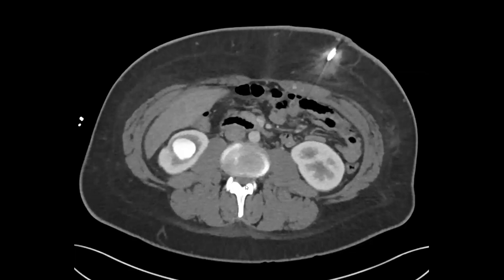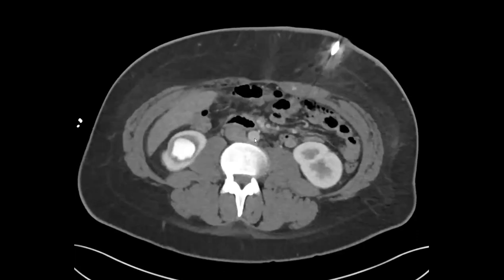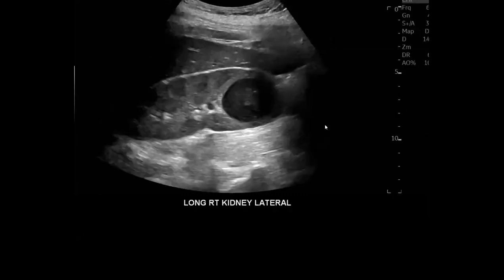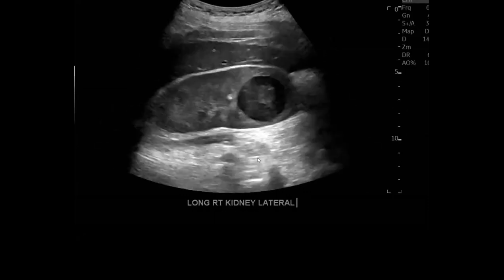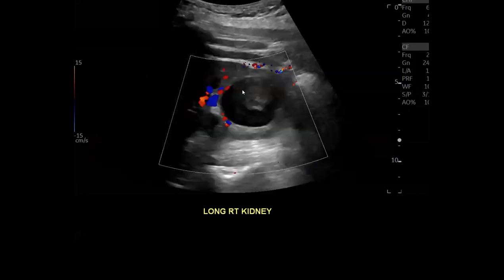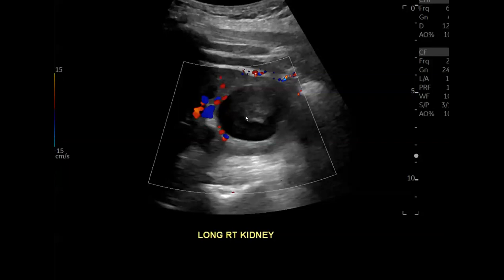The other weird thing is it looks much brighter than the aorta, and pseudoaneurysms typically follow aortic density. Then on a recent renal ultrasound you can see the lesion again — they put flow on it and there was no apparent flow. So the pseudoaneurysm theory doesn't hold because a pseudoaneurysm should have yin-yang flow, and if thrombosed it shouldn't look this bright on CT.